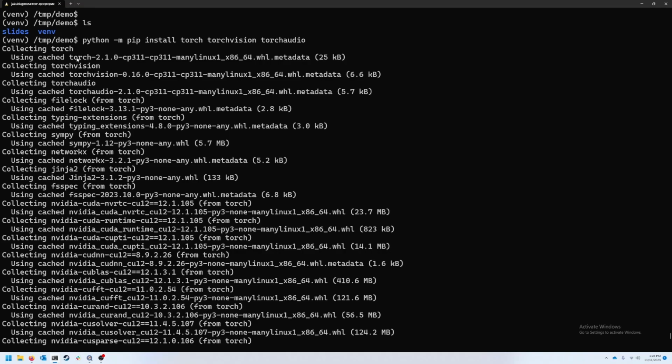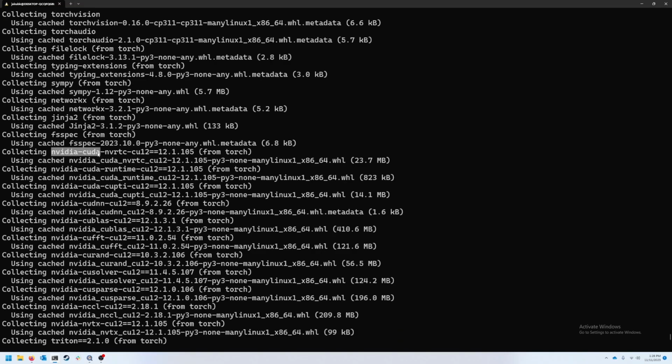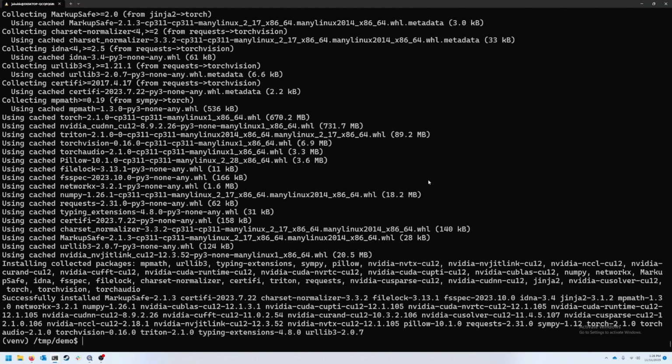So let's see. I would like to let you all know that CUDA is installed automatically when you install PyTorch. CUDA as well as CUDNN. And this is a massive help because we as users don't have to try to find the precise version that needs to be installed, log into an account to get CUDNN. So this is really fantastic. So thank you so much PyTorch and NVIDIA developers and everyone else who made that possible.